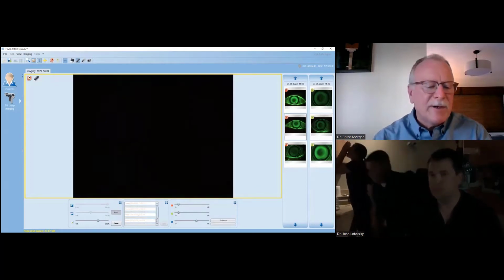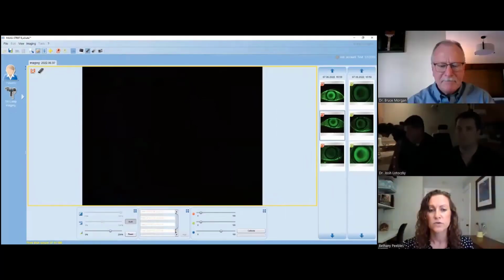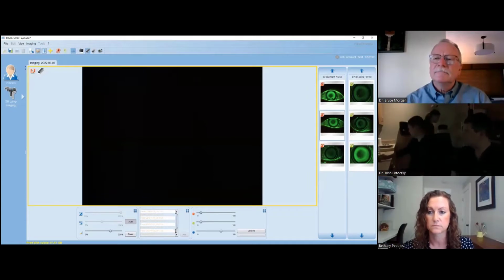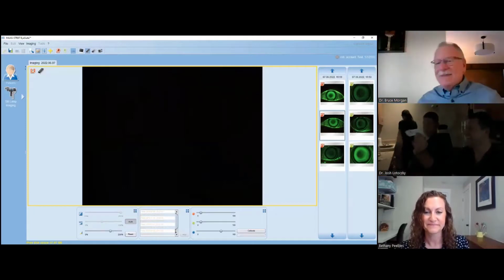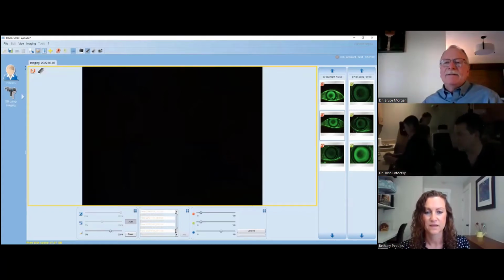Bethany, are there any other pointed questions regarding the fluorescein patterns? There isn't really anything regarding the fluorescein pattern, but we certainly could answer while we're waiting. There was one question that was curious about what fluorescein you're actually using. For a while, it was whatever we could get our hands on. Mix your own, yeah. BioGlow. Pretty traditional single strip. Perfect. So yes, we have BioGlow strips.